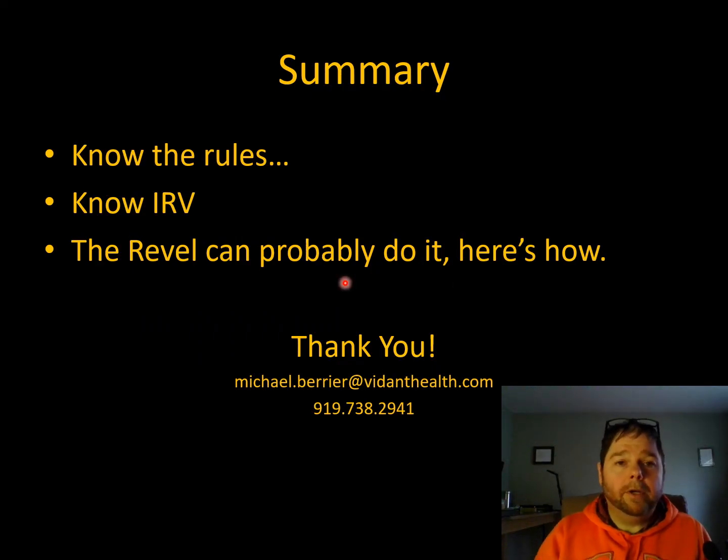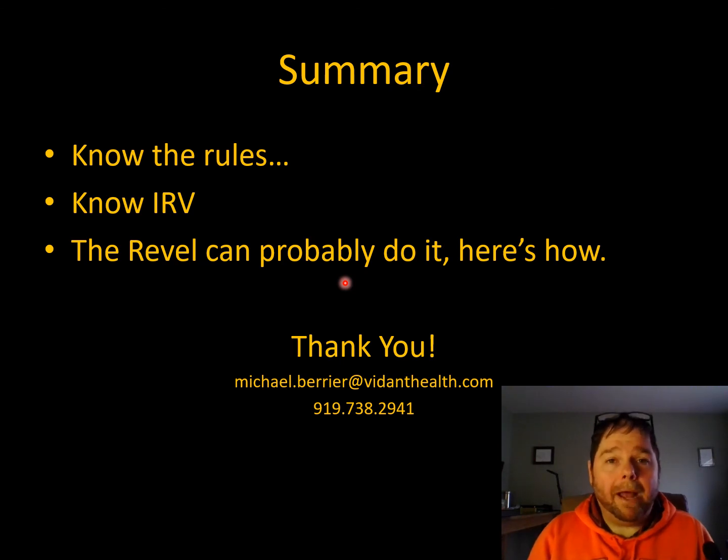So, in summary, again, know the rules. If you understand the rules about how to oxygenate, how to ventilate, and how to respond to pH changes, then setting up and running the ventilator becomes pretty simple, as long as, again, you know what your goal is. Know about inverse ratio ventilation, know how to do it, keep that reference handy, and remember, the most important thing I can tell you about inverse ratio ventilation is it is almost a last resort.